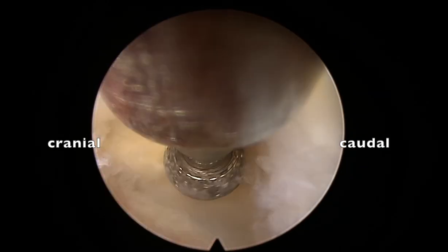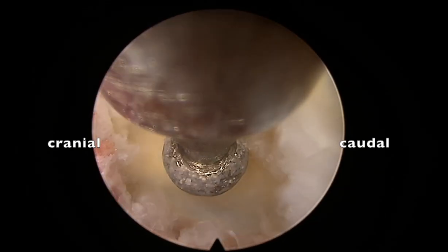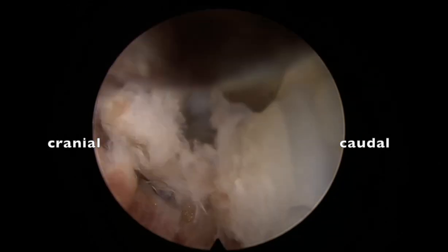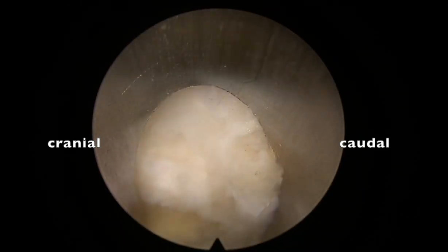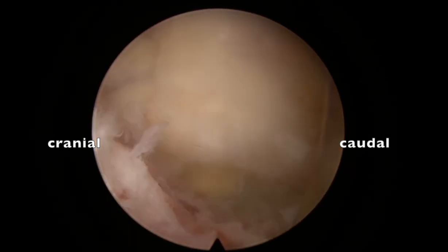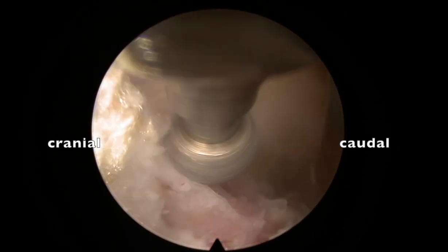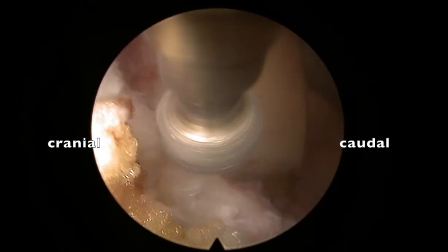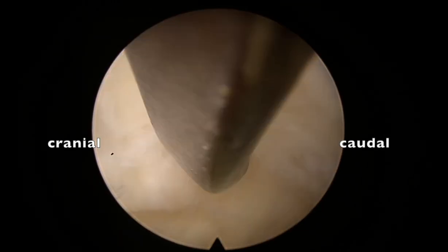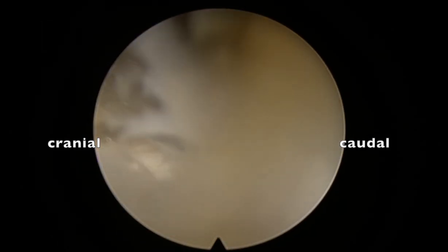Always when using the drill, the direction of force should be outwards, not anteriorly, so that it does not plunge. Now I push the sleeve inside and check for movement. The sleeve is snugly fitting, but there is still some bone pinching the sleeve. I drill that edge of the facet just a bit so that my sleeve sits snugly straight, not obliquely.